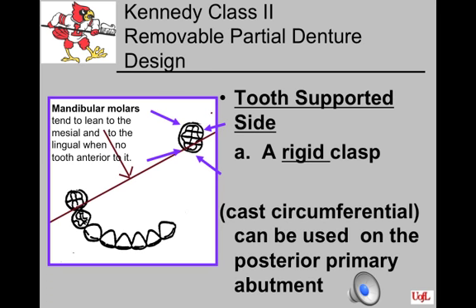If it must stick way out, then the ring is a better solution over plating on the lingual. Remember, the reciprocal component must be all above the survey line and in the middle 1/3 ideally, so it is best placed on the surface with the lowest survey line.